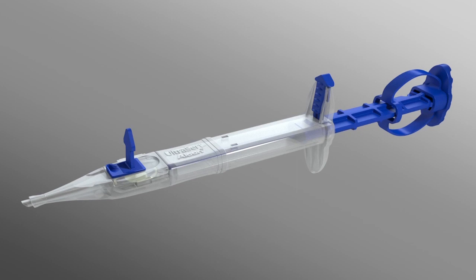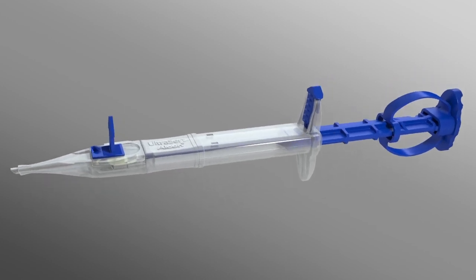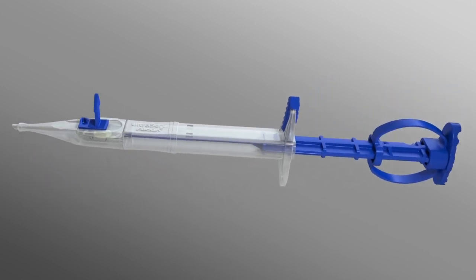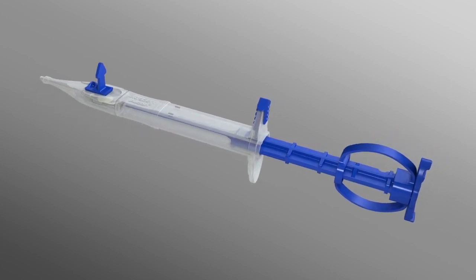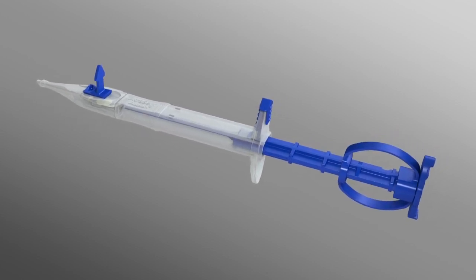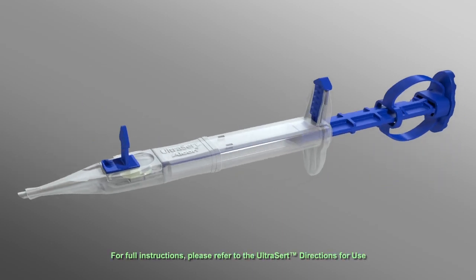This innovative, single-use device is designed for simple, smooth, consistent implantation of the AcrySof IQ intraocular lens. The Ultrasert delivery system is ready to use in three simple steps marked by blue action indicators.